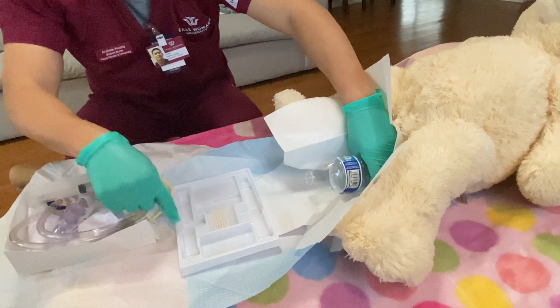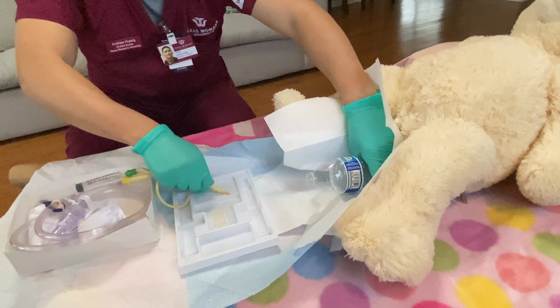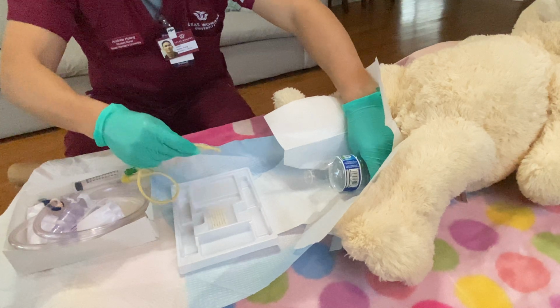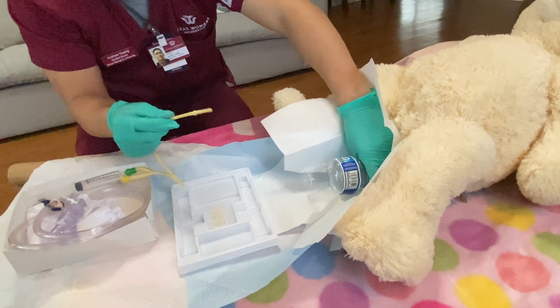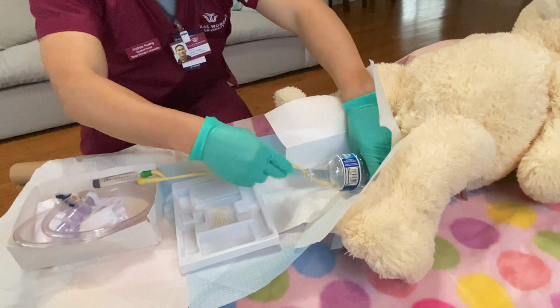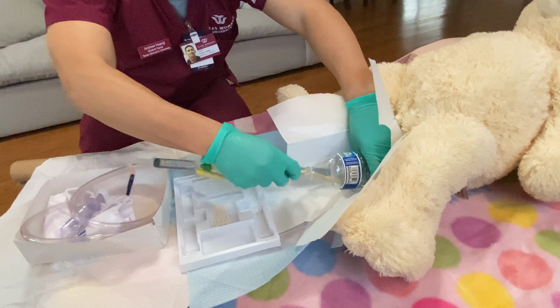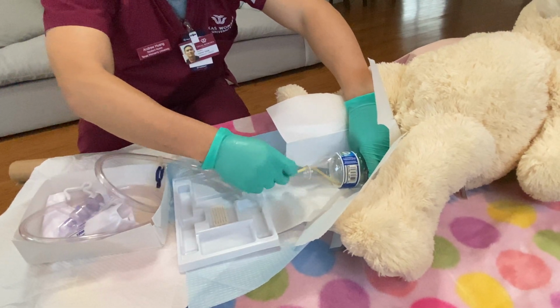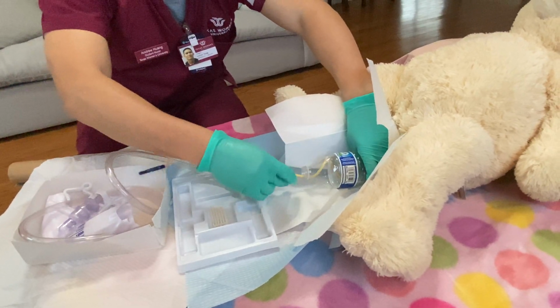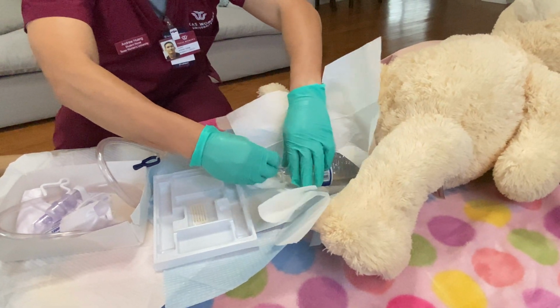Now I'm going to grab the catheter tip and dip the first 1 to 2 inches in the lubricant. And now, Mr. Jones, I'm going to insert the catheter right now. And I'm going to advance it until I get to the Y. Okay. So now we're at the Y. I'm going to use my non-dominant hand and grab the Y and hold the Y in place.